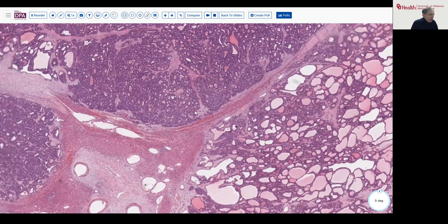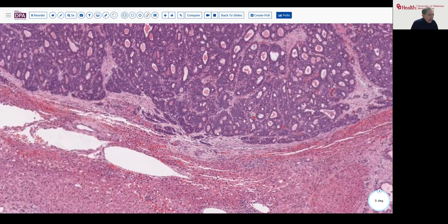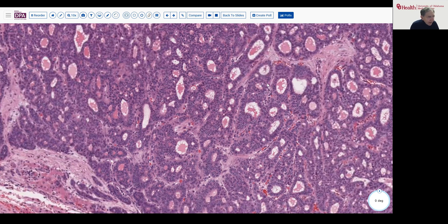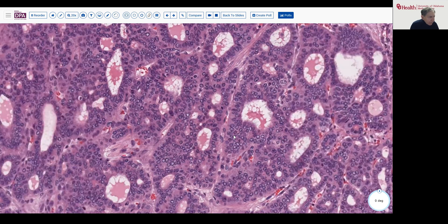These are the features that we saw on the biopsy — these somewhat open spaces surrounded by nuclei with low grade appearance, but prominent nucleoli, a few mitotic figures, and so forth.